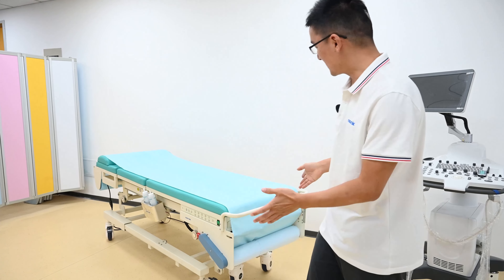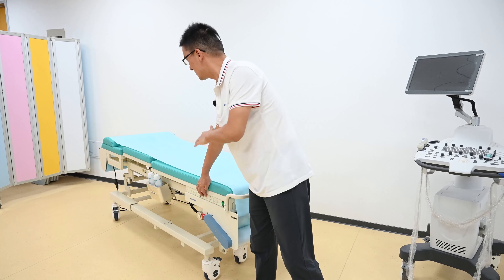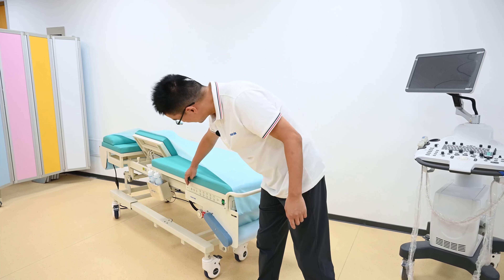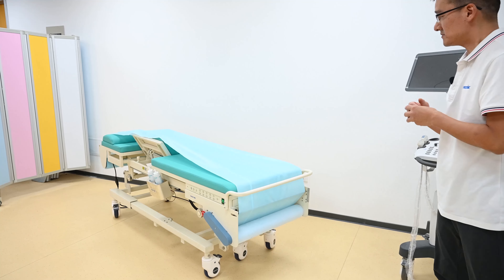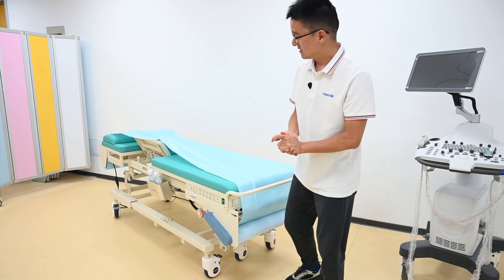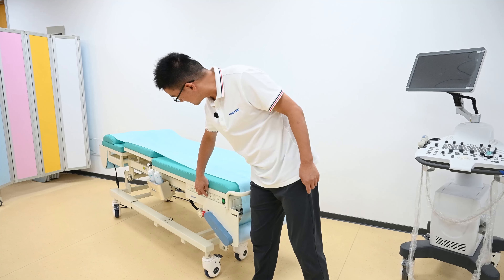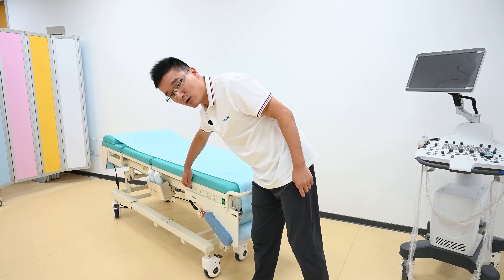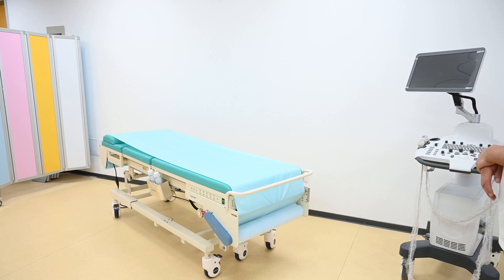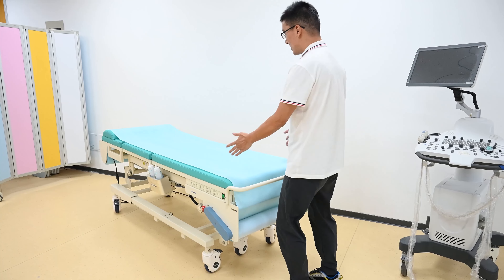There is a point mentioned before — the automatic paper correction system — and I want to show you again. We operate the side support up, and you can see the paper starts to become disordered, with the paper drifting and deviating to one side. But after operating it back and running the paper rolling again, you can see the deviation is disappearing. The correction system is working perfectly.